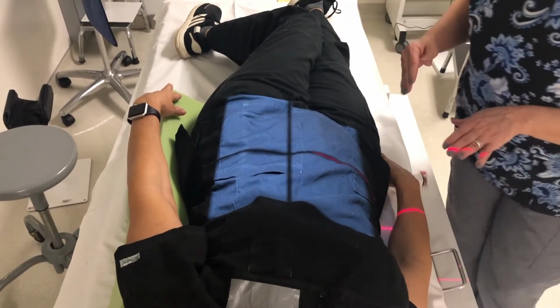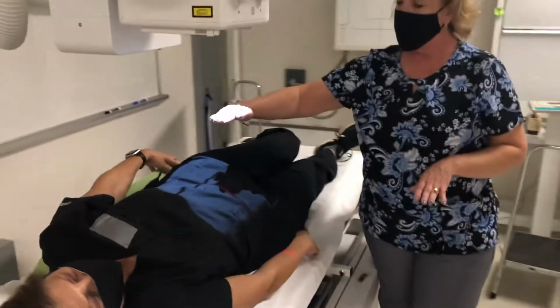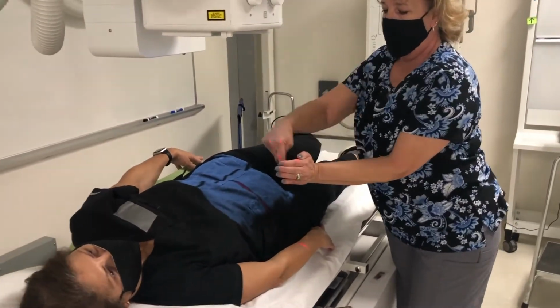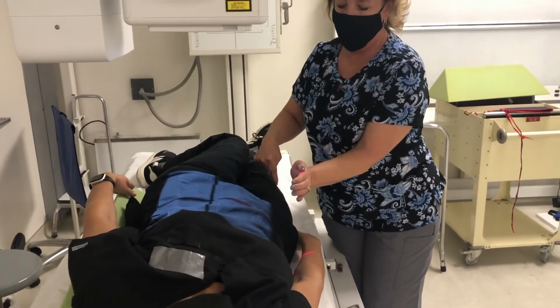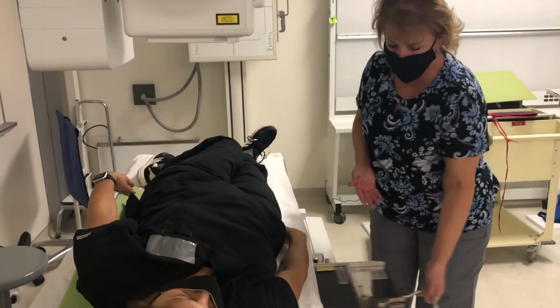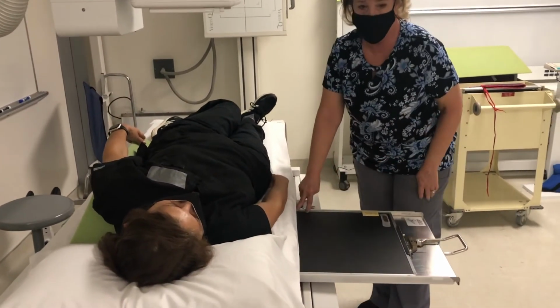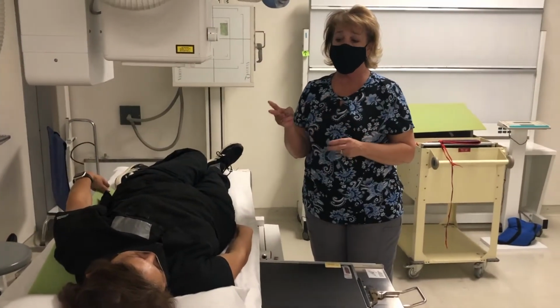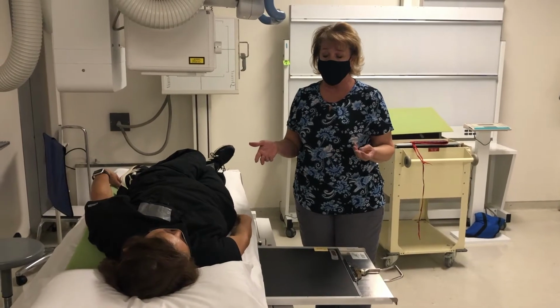So this would show the left kidney in profile and the right kidney collecting system and ureter. So I would do an RPO at 20 minutes, swap out the cassette, put my left marker and a 20-minute, because these two images should only take you about a minute to do. You're going to be pretty rapid doing this.